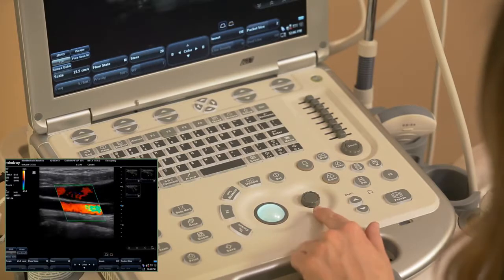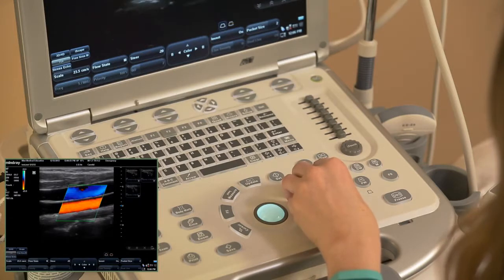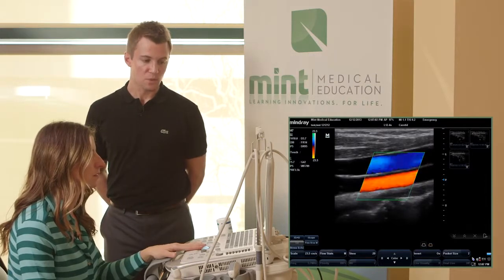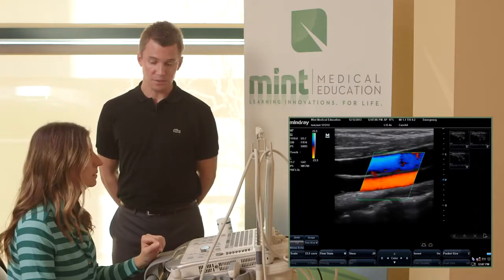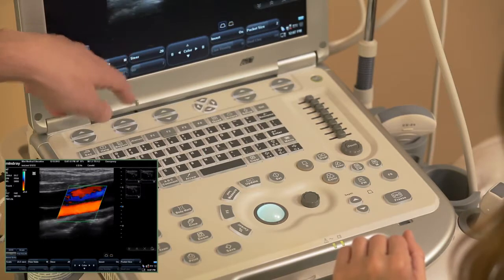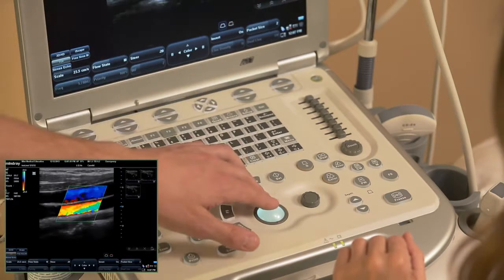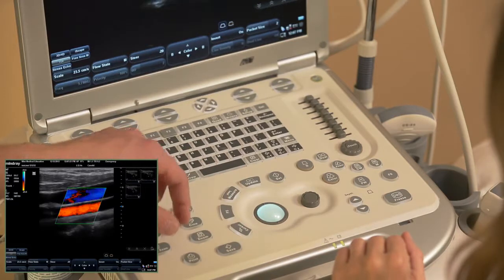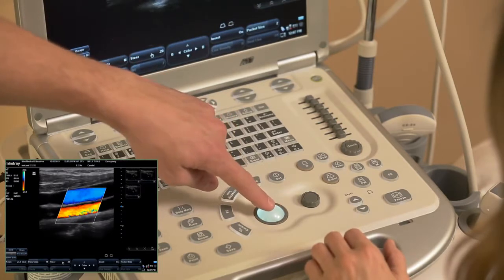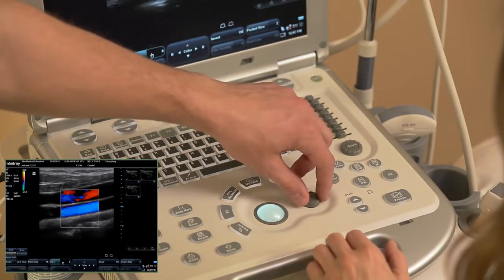So by default, I found out that this is the steer. It is, yep. Just like you've used that in the past to control some other functions, when using the color Doppler, you can use that rotary nav multifunction key to steer the box. That's nice. And one thing I want to point out, since I mentioned earlier that there's usually a couple different ways to do things, you can actually use the soft keys again to steer those. So we see that steer is right up there on the screen, and we can use those soft keys to change the direction of the steer as well. Okay, great. And then one more, just for good measure, if we get our cursor back on the screen, and you move that cursor over to steer, you can use that set button to select it and move it, or you can also use that multifunction rotary nav key.